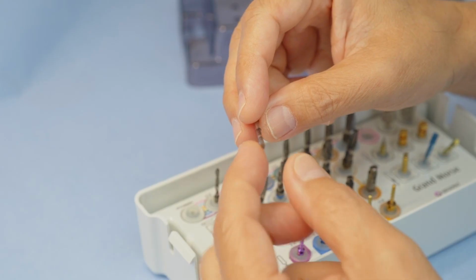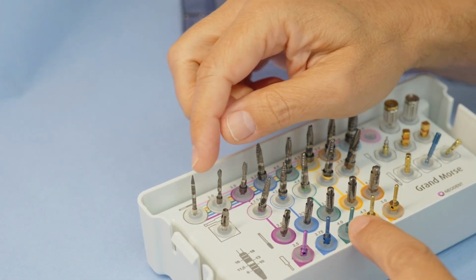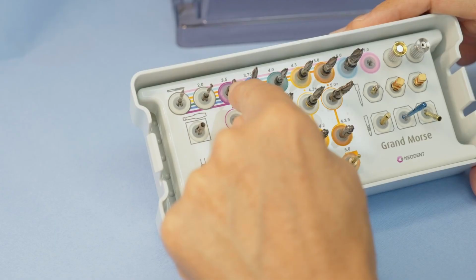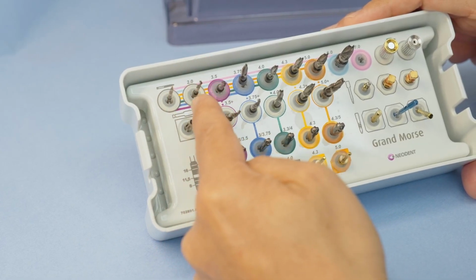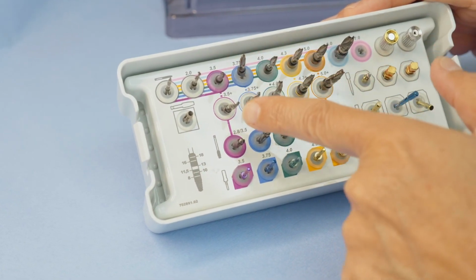After that, all you have to do is follow your drilling protocol based on the system that you're using. Here you can see that after the lancet drill, I'm going to go to the 2 millimeter drill, and then I'm going to go to the 3.5 if a 3.5 millimeter implant is the one that I'm going to be using. If it's a 5 millimeter drill, then I'm just going to follow the colors. I'm going to follow the lines that take me all the way from that lancet drill to the 5 millimeter diameter implant. And once I select that implant, the only other thing that I have to think about, at least for the system that I'm using, is the quality of the bone. Is it a soft bone or is it a hard cortical bone?